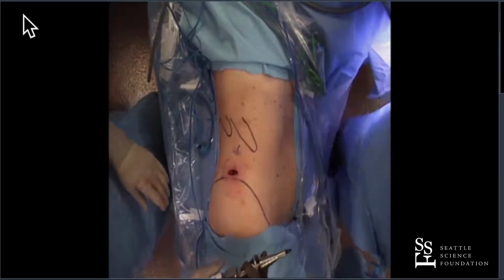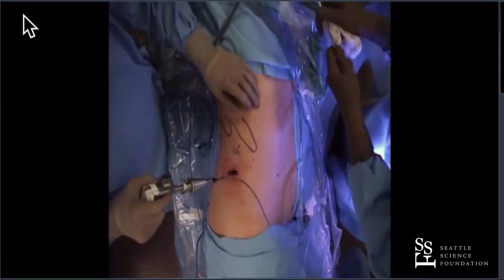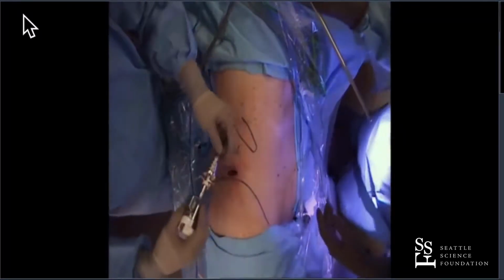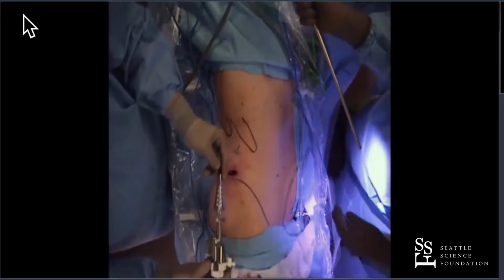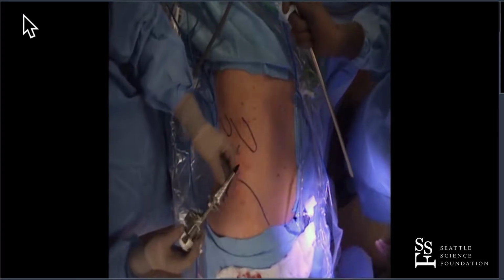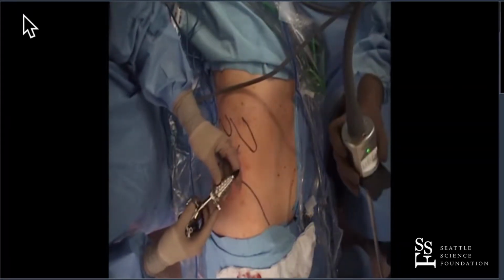So if we go back to external view, this is the Hassan I was telling you about, and this is what we're going to use for our first port, and I think it works great. There's an adjustment here on the Hassan. You can make it deeper or you can make it shallower, and that makes a difference.